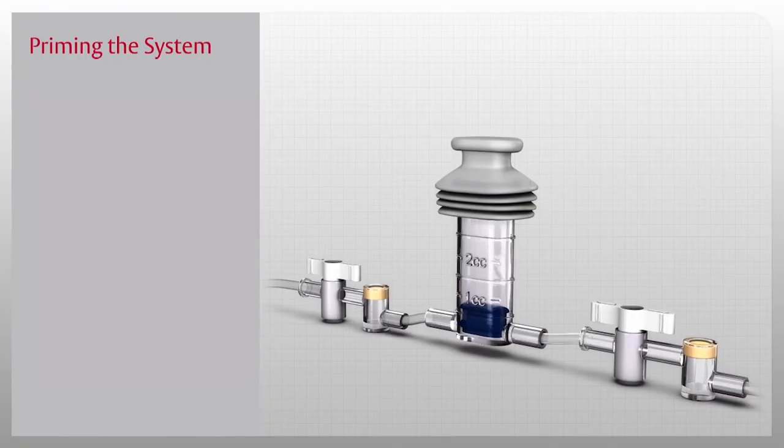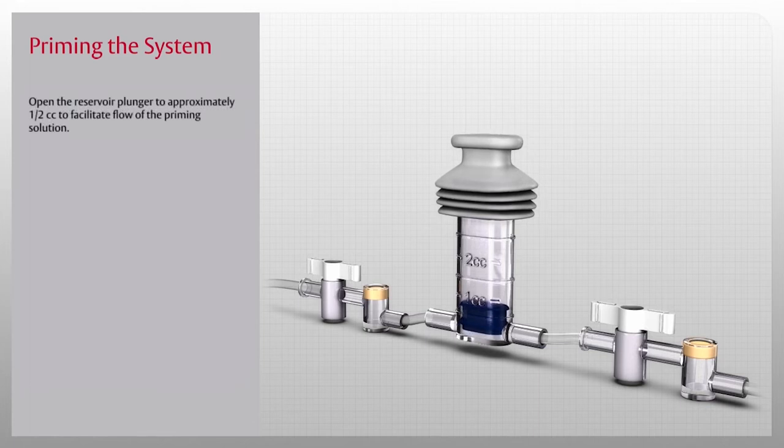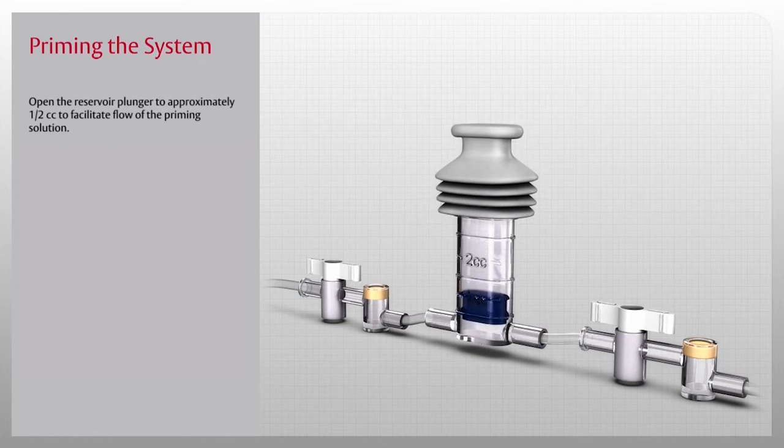Now that you have set up the Vamp Junior system, let's learn how to prime the system. First, open the reservoir plunger to approximately one-half cc to facilitate flow of the priming solution.